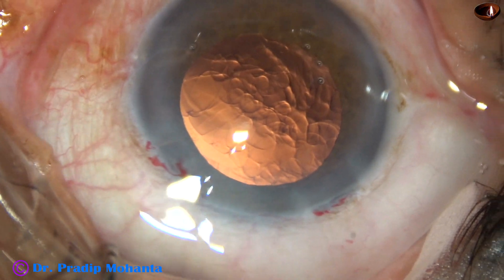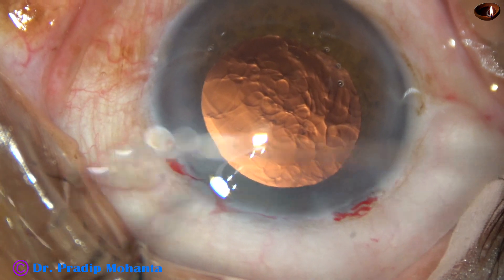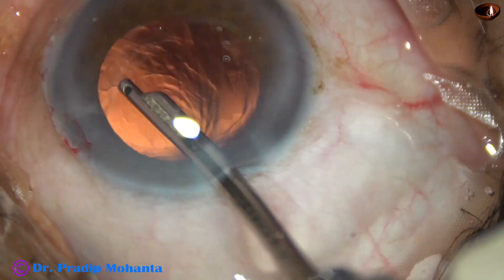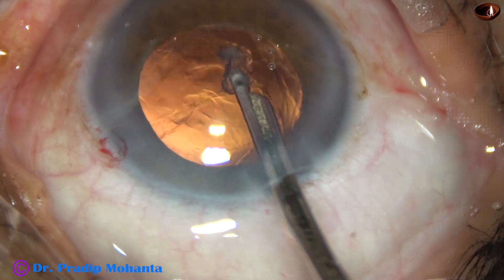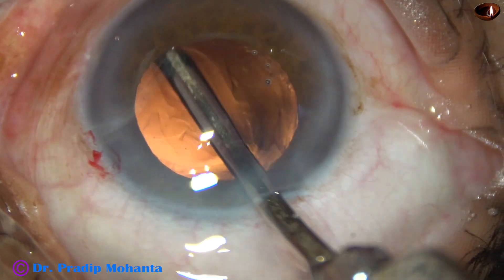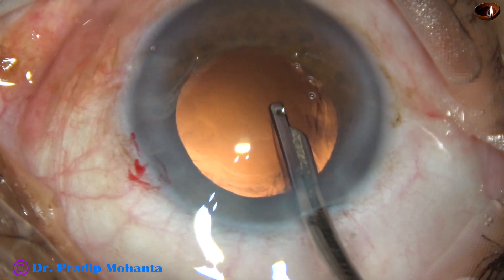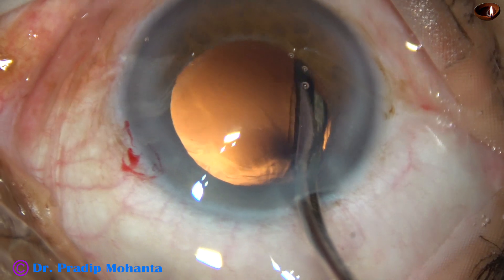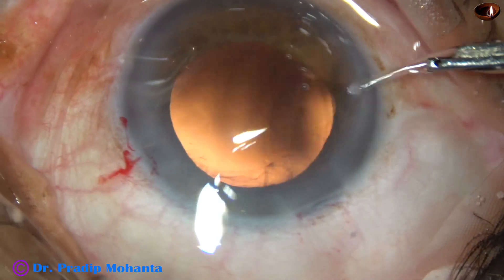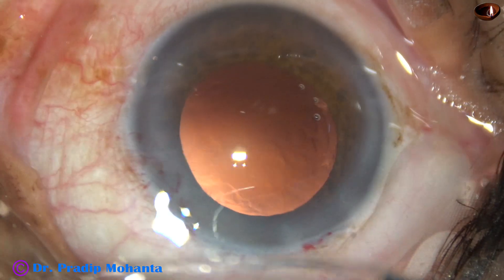And now we have to clean the cortical matter which is right now covered by the iris. You can see a lot of cortical matter is there, but it was covered by the iris. This is a 23-gauge Simcoe cannula, and this is the sub-incisional cortex.